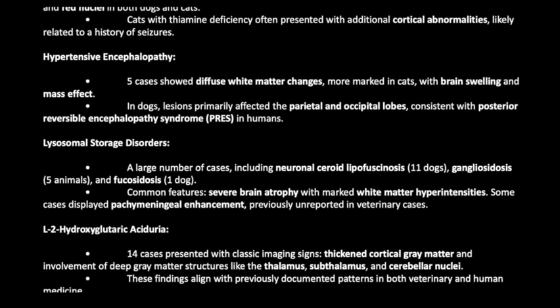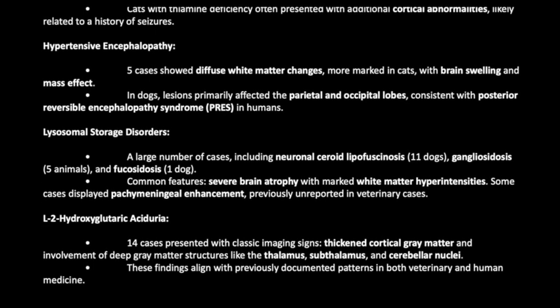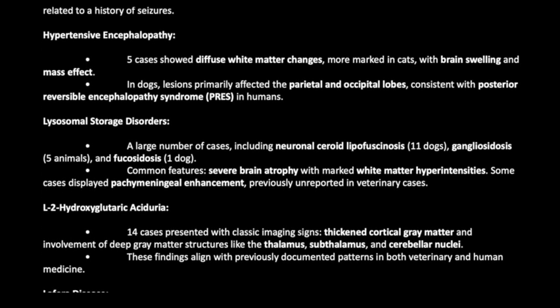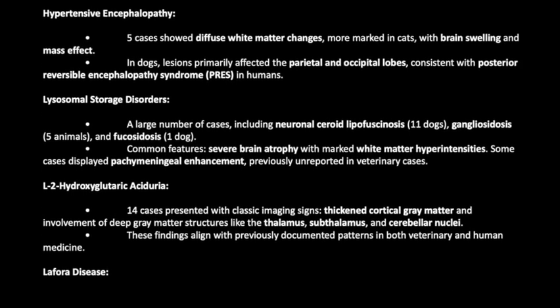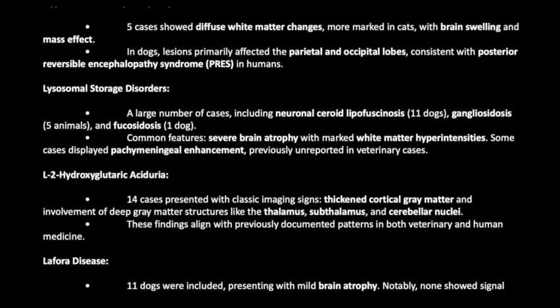L2-hydroxyglutaric aciduria: 14 cases presented with classic imaging signs: thickened cortical gray matter and involvement of deep gray matter structures like the thalamus, subthalamus, and cerebellar nuclei. These findings align with previously documented patterns in both veterinary and human medicine.